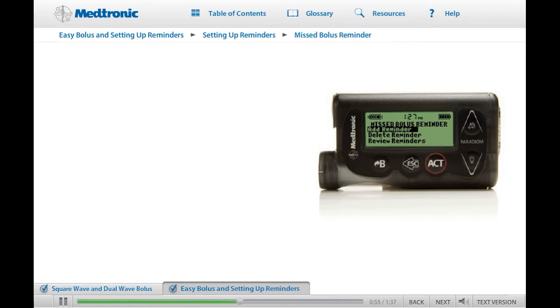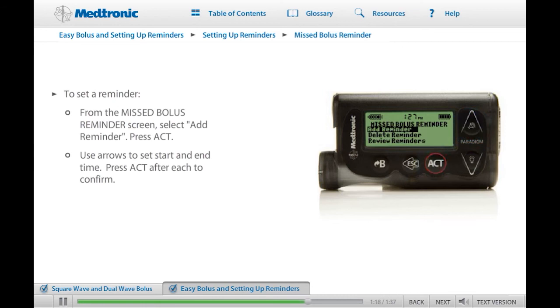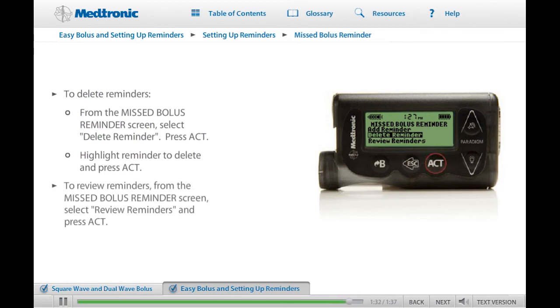To set a reminder, from the Missed Bolus Reminder screen, select Add Reminder and press Act. The start time will be flashing. Use the up and down arrow buttons to adjust the start time in 30-minute increments. When you have set the start time, press Act. The end time will be flashing. Set the end time in the same way. Your pump will allow you to set as many as four Missed Bolus Reminders. To delete reminders, select Delete Reminder from the Missed Bolus Reminder screen and press Act. Highlight the bolus reminder you want to delete and press Act. You can review reminders in the Review Reminders screen on the Missed Bolus Reminder menu.